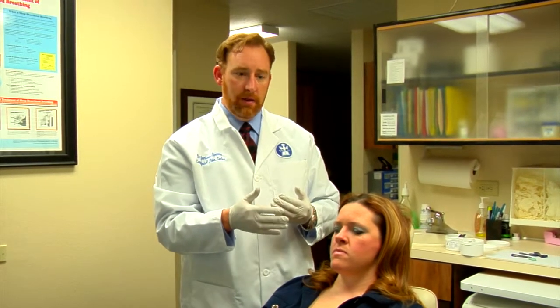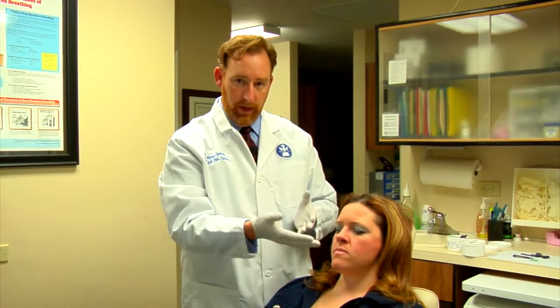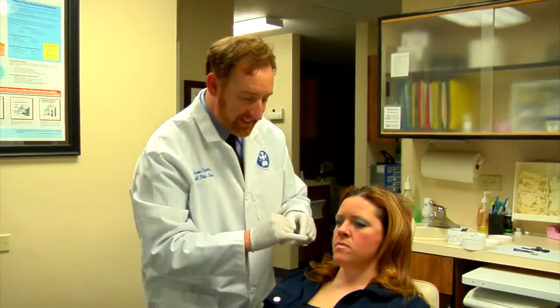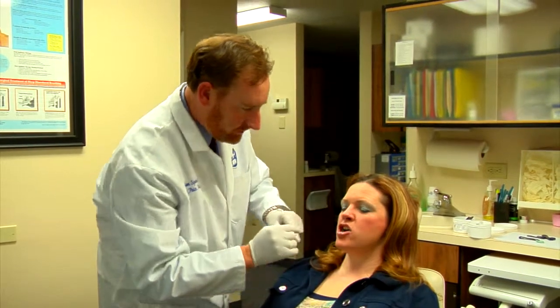This material can be redone. So if, for example, the patient decided that that was a very uncomfortable position for them, we could rip out the material and start over. That could be done as many times as necessary. If we decided that the post-operative position needed to be a more advanced position, like we have here, that would be fine, but perhaps the position that we'd like the patient to use at home while we're waiting for the sleep study, while we're waiting for definitive diagnosis, is not quite so protruded. Maybe we would take it back a little bit. So all of those things can be done relatively easily by just removing the material, putting in new material. Let's see if that's set. Just takes a few moments here. Let's give that another minute.